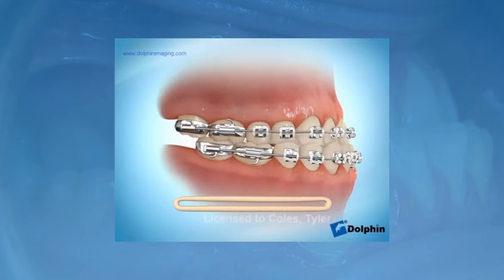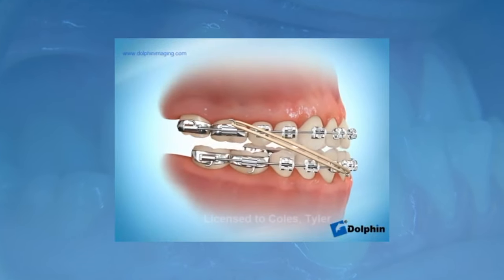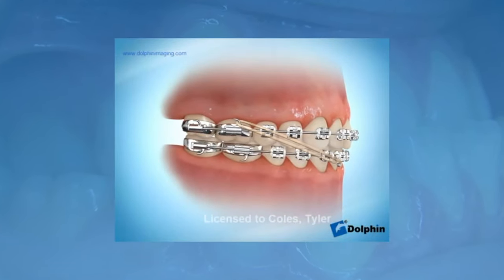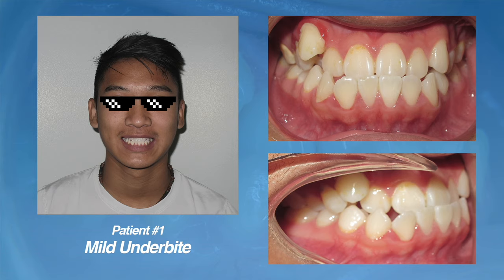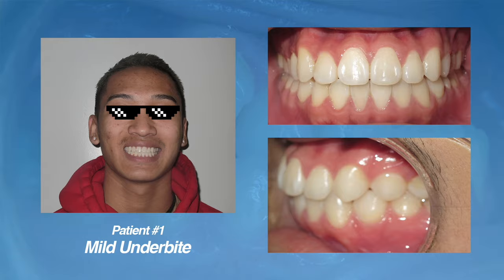As you can see in this animation, by connecting a rubber band in this direction, over time the top teeth will be pulled forward and the bottom teeth will move back. With this patient, you can see that with braces plus rubber bands, he was able to get his underbite fixed and got a great result.